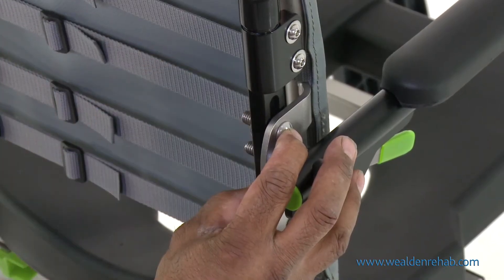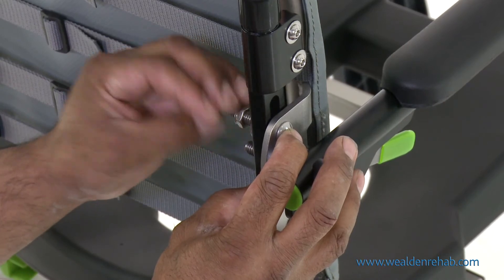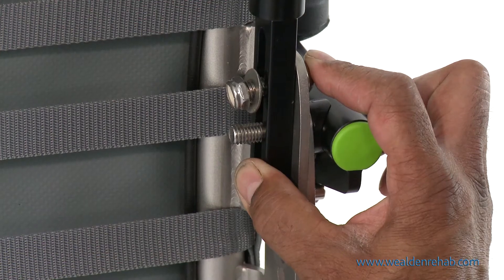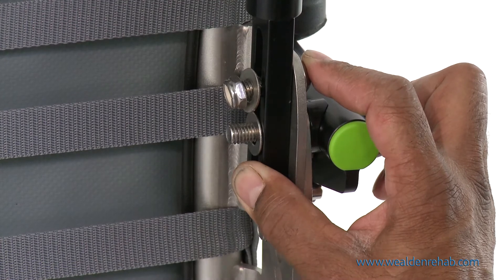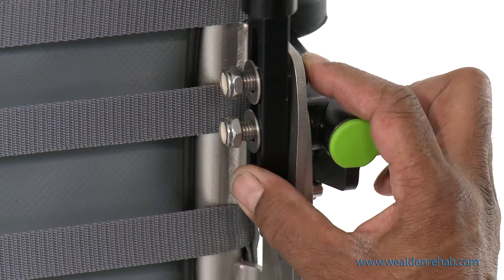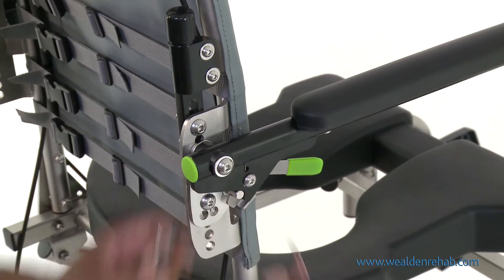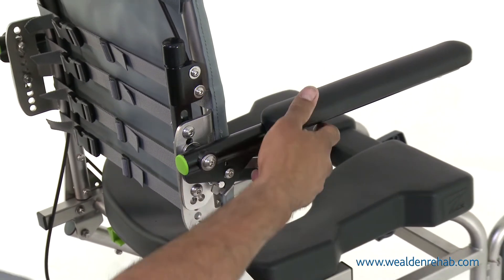Put on the washers and nuts and tighten using the appropriate tools. Check that the armrest tension is correct.